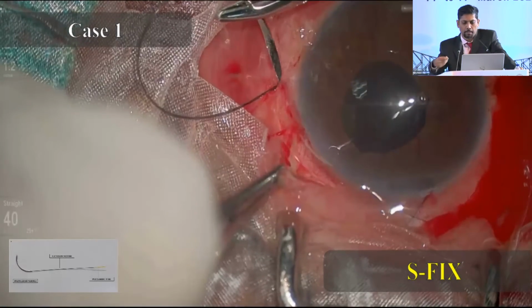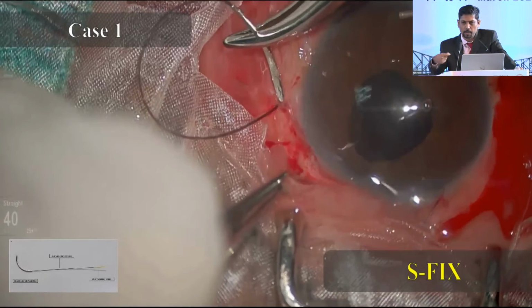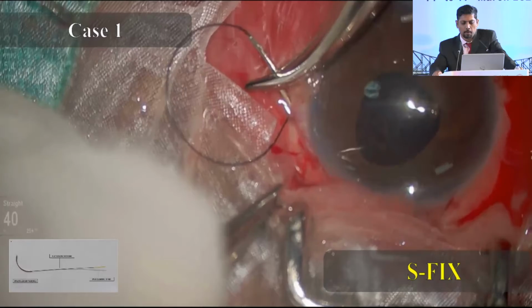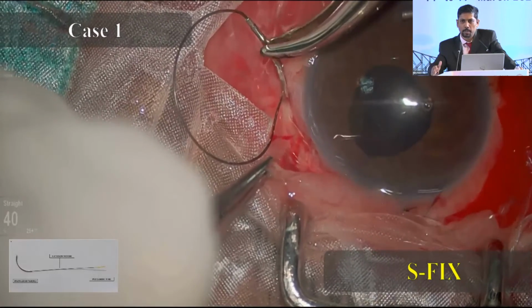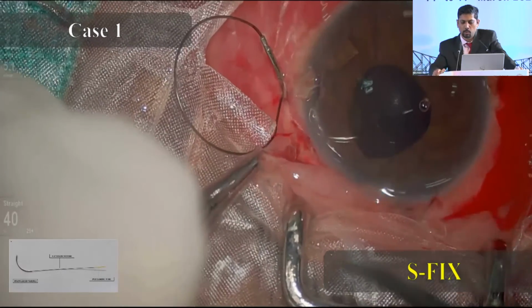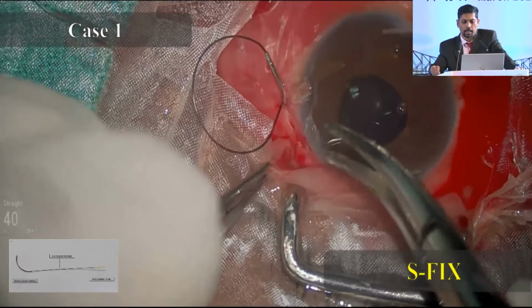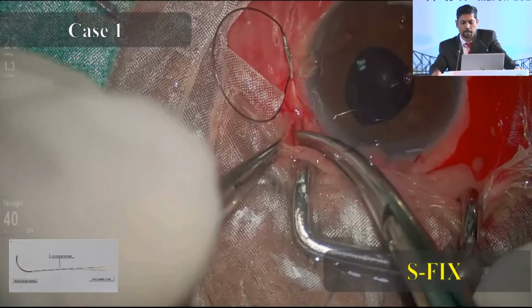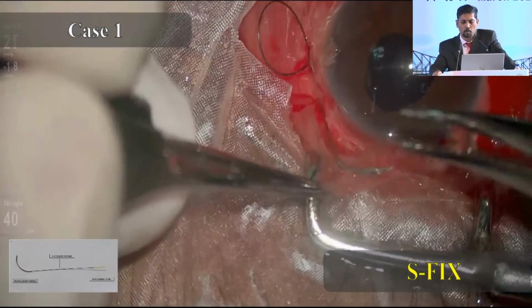The nylon suture is flexible. You can bend it, maneuver it, and take a suture bite, start from the point of sclerotomy and traverse for around 2 mm and come out. In case, probably as a beginner when you are doing initial cases, you can always open the conjunctiva. In case there is excess chemosis, again you can open the conjunctiva, visualize it comfortably. But I'm sure after that you won't probably need it.